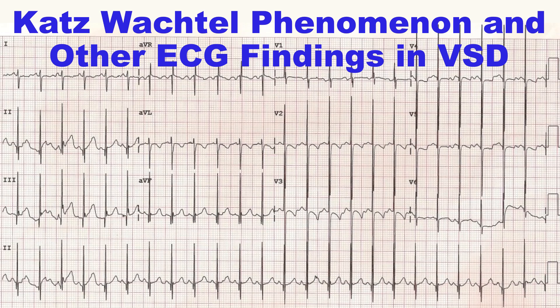The Katz-Wachtel Phenomenon consists of tall diphasic RS complexes at least 50 mm in height in leads V2, V3, or V4 — the mid-precordial leads. The QRS amplitude is high and often overshoots the margin of the ECG graph, as seen in lead V4 in this case. It may be necessary to take the ECG in half standardization, i.e., 5 mm per mV instead of 10 mm per mV, to capture the full QRS complex without overlapping with other leads.